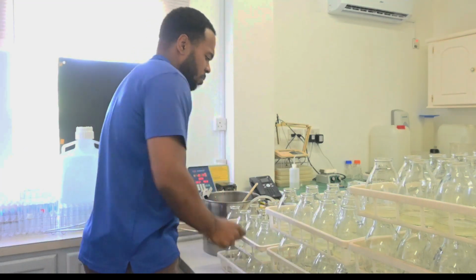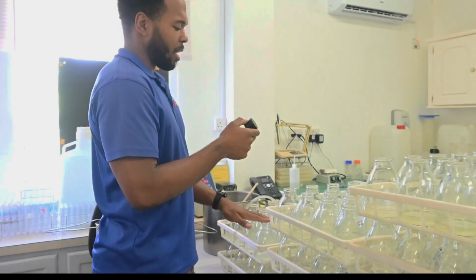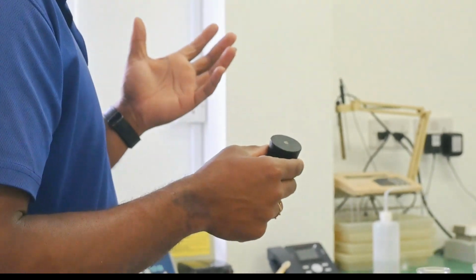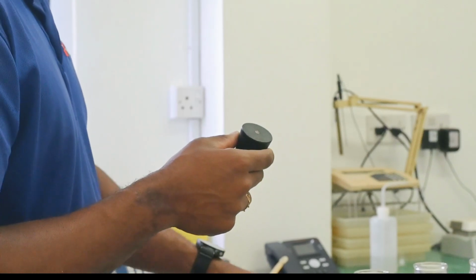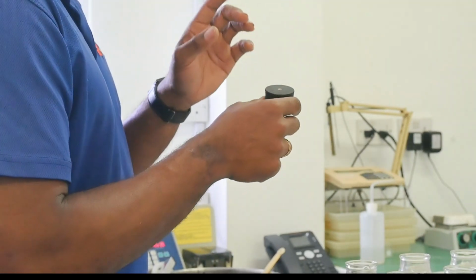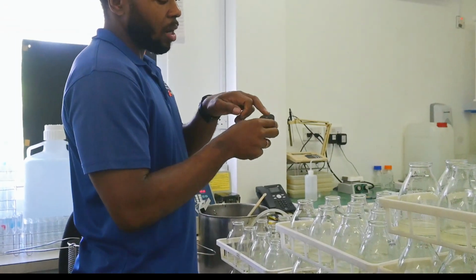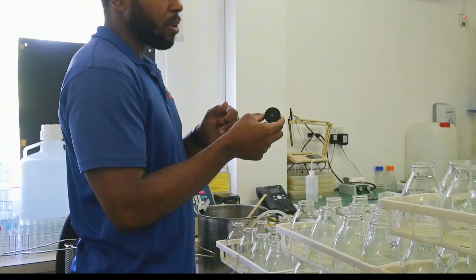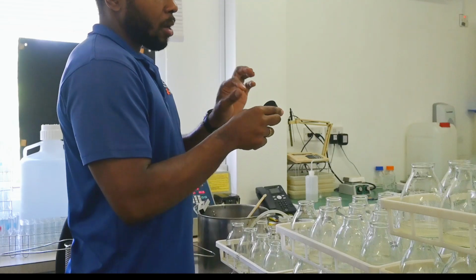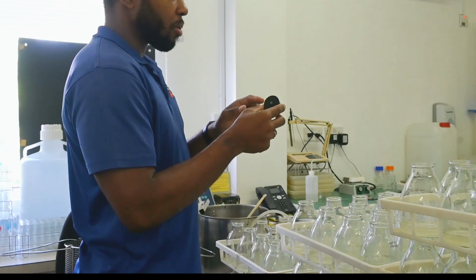The next one is to cover those bottles. The cover has a specific function. It prevents the air from entering into that bottle, which reduces the contamination rate due to air quality issues or any microorganisms that may be on the surface of that bottle, dust particles, anything from entering that bottle. But the plants do need gaseous exchange. So the purpose of the hole in the cover is to place a piece of cotton which acts as a filter to kind of mitigate the amount of air that gets into it, and whatever is in the air to at least be filtered to some degree.